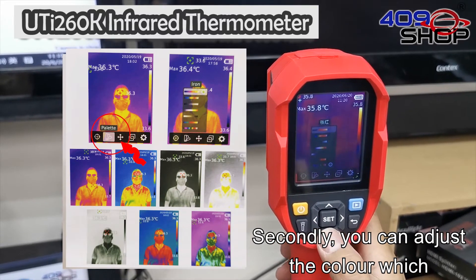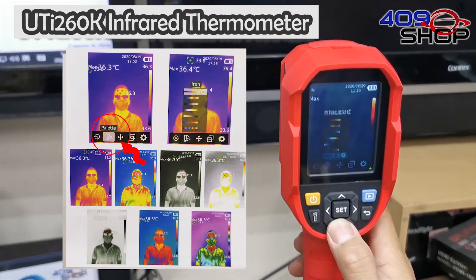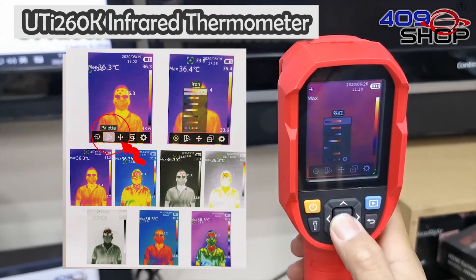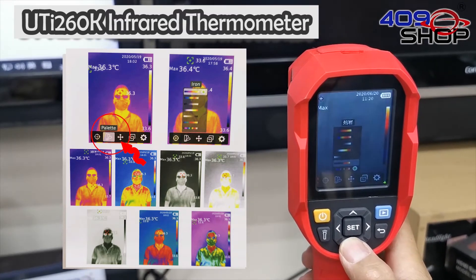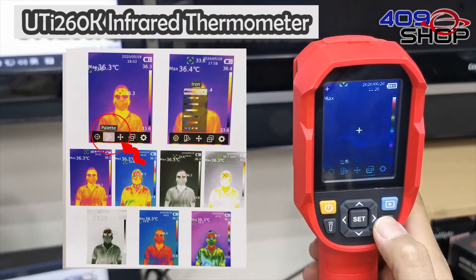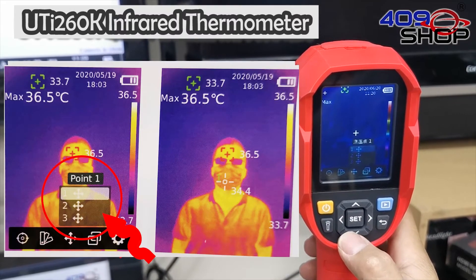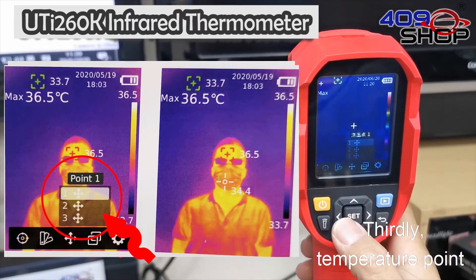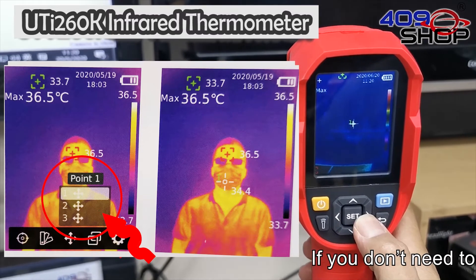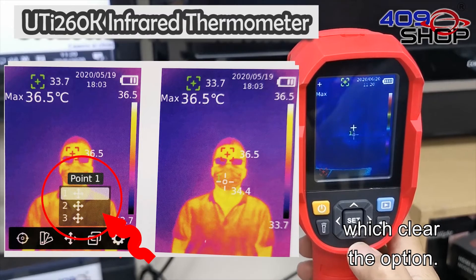Secondly, you can adjust the color shown on the screen using the palette. Thirdly, the temperature point setting is for choosing a position that you want to measure. If you don't need to set up the measuring point, you can tap the button again to clear the option.